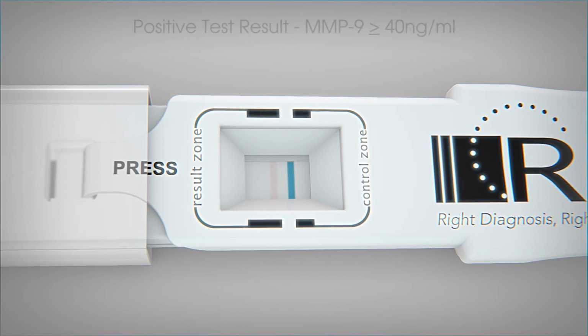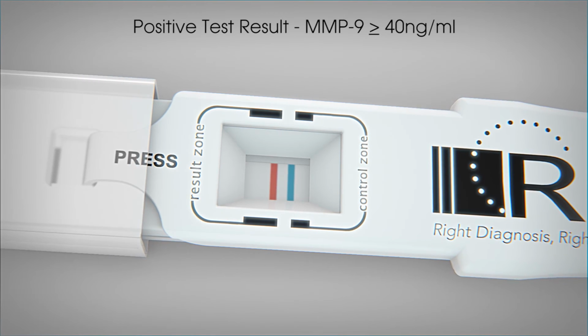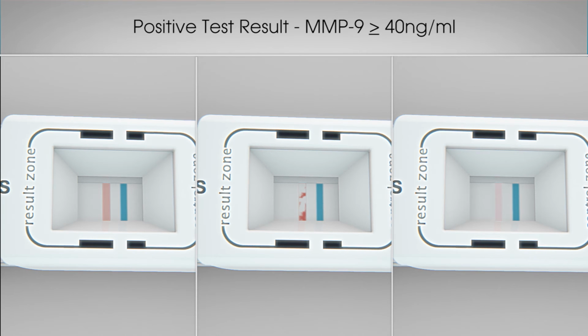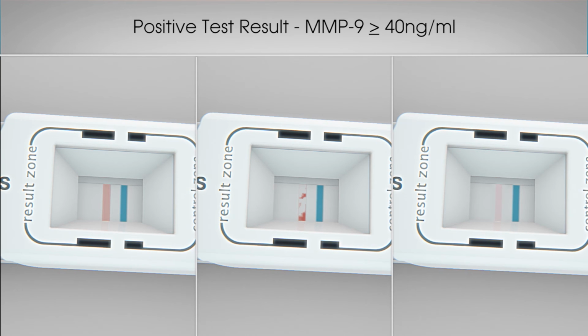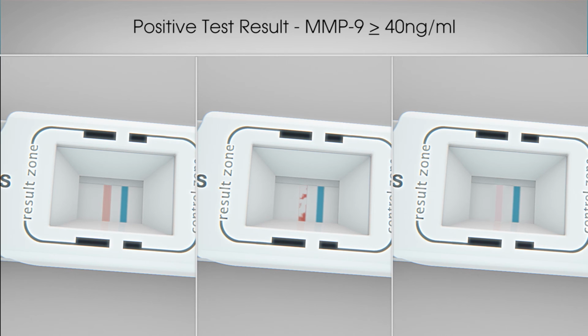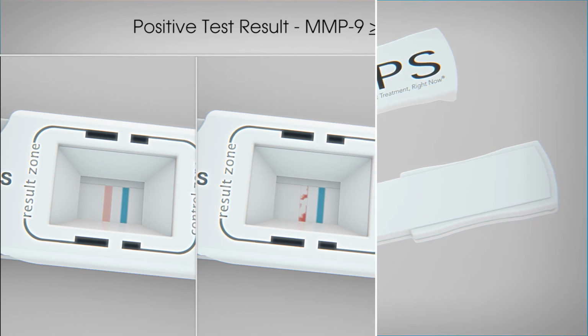The presence of both a blue line in the control zone and a red line in the result zone indicates a positive result. Any form of a red line, whether faint, broken, or shadow, is indicative of a positive test result. A positive result indicates the presence of matrix metalloproteinase 9 in tear fluid is greater than or equal to 40 nanograms per milliliter.